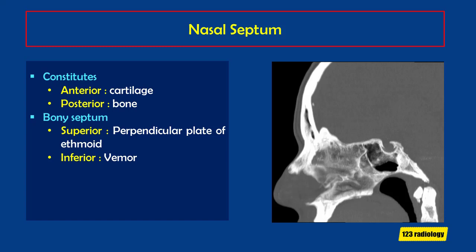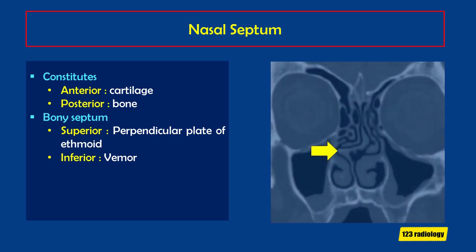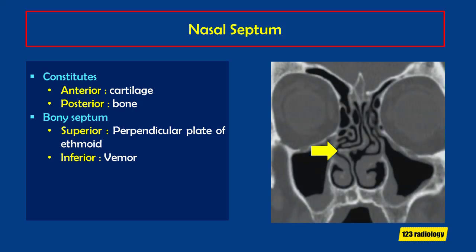The nasal septum has bony and cartilaginous components. Superiorly, the perpendicular plate of ethmoid bone forms the superior septum. Posteriorly we have the vomer bone, and anteriorly the septal cartilage. On coronal imaging, you can see the perpendicular plate of ethmoid intersects with the vomer, forming the nasal septum.